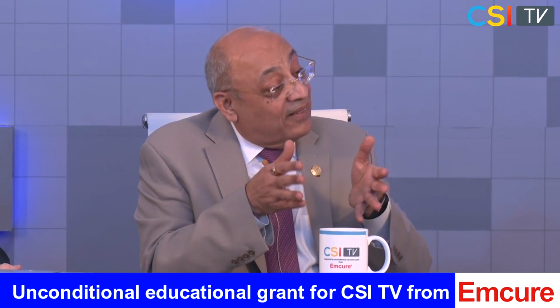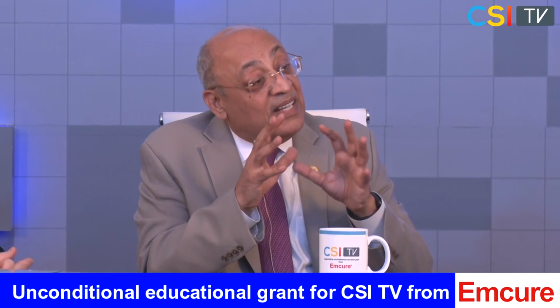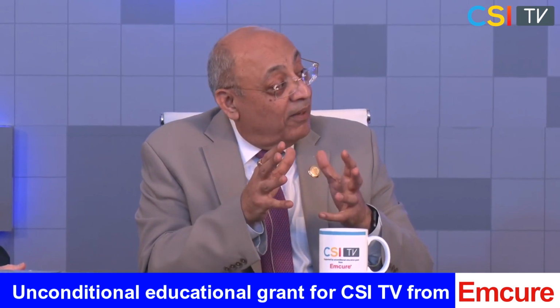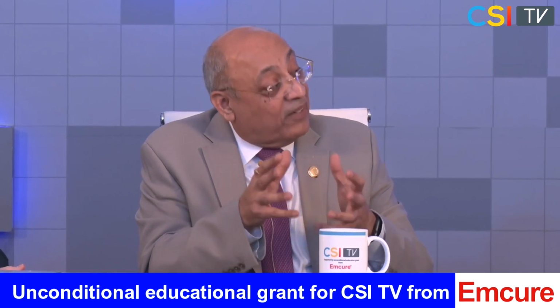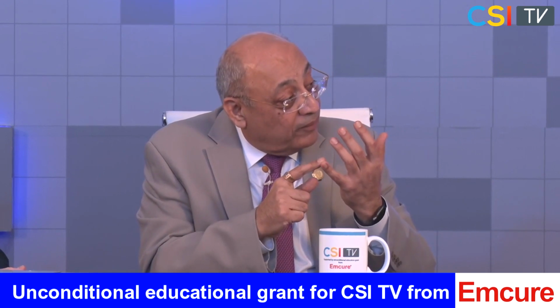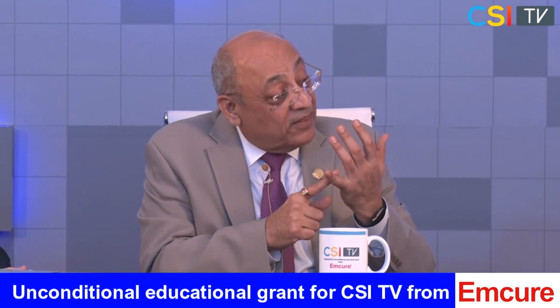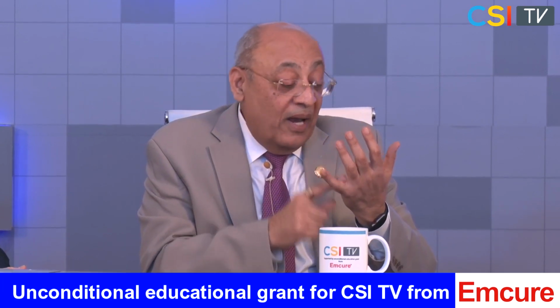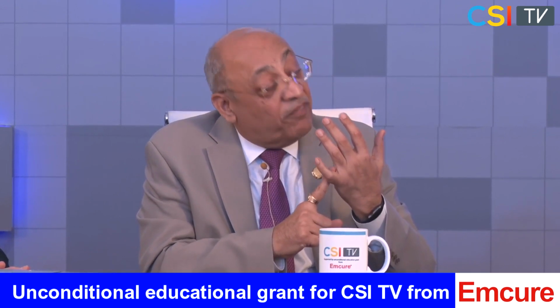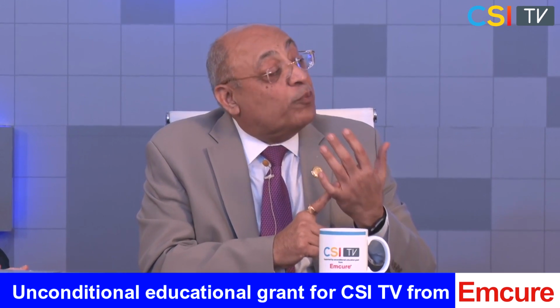So, as it stands, CT-FFR, or CT angiography, should be able to give us a triply effective phenomenon, including the stenosis, the plaque characterization which is likely to contribute to it, and finally the FFR also, making it probably a preferable diagnostic modality which we should explore further.